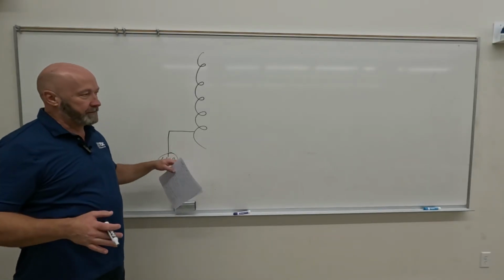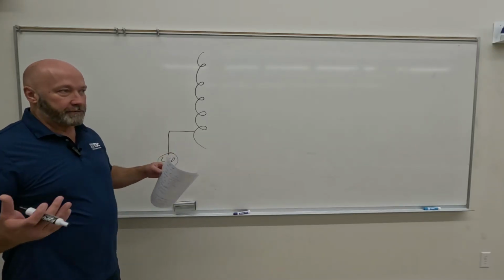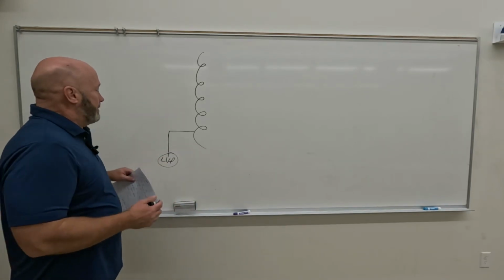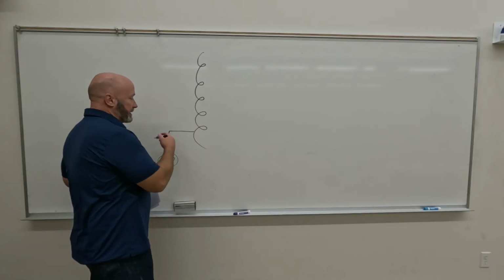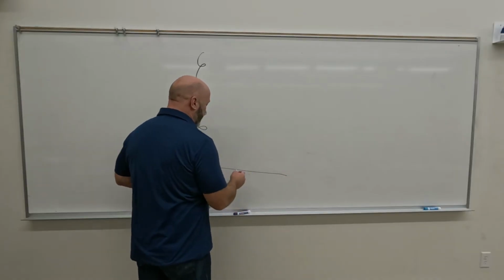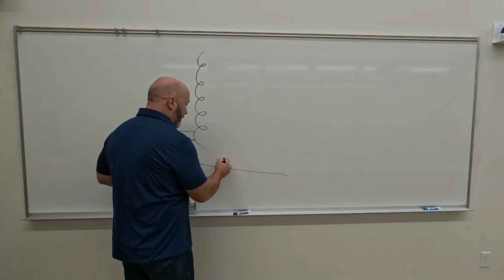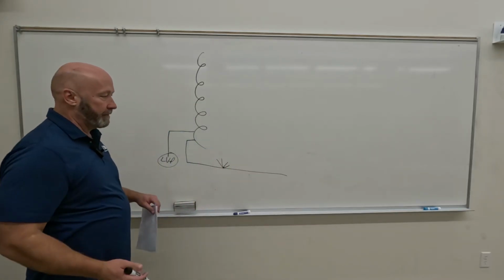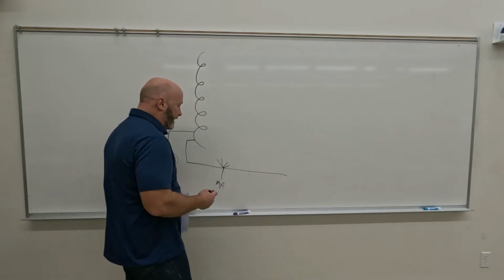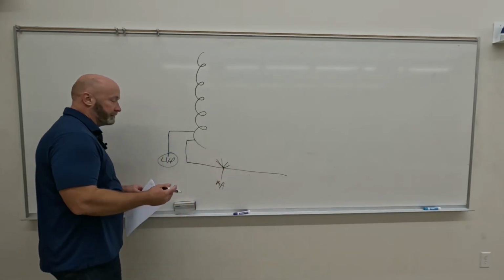All the names for the autotransformer, I'm not going to go through them, but you know them. Also, how the autotransformer works, we're not going to review that either. We've done that to death. So line voltage compensation is the first thing it gets to, and it feeds into the autotransformer, and we've got a secondary circuit that comes off of that. On the test, just by virtue of where these things are, you should be able to pick them out. So you've got the mA selector.